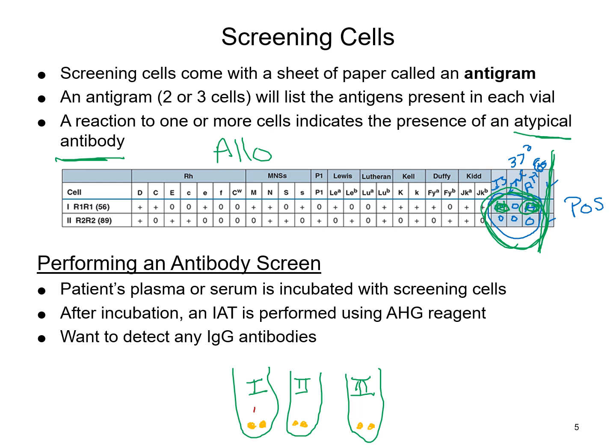So to tube 1, you would add a drop of the reagent screening cells that are for vial 1, and then vial 2 and vial 3. So each of those gets their particular reagent that is labeled for that tube. And then from that, you would take that through those 3 phases of testing that we referred to up here. So you would do your immediate spin. If your particular lab uses anything like your LISS reagent, then that LISS reagent will actually be added.